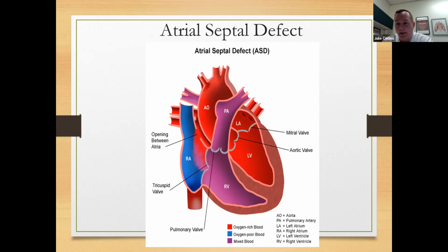90% of that they can actually get closed in the cath lab, and the other 10% will need surgical intervention. In the cath lab, they do a device closure, but the device closure doesn't always work. As you can see, when I got called in a week ago, sometimes if there's not a good ridge, not a good landing site when they deploy it, it can migrate. And on the kid last week, it migrated into the right ventricle.